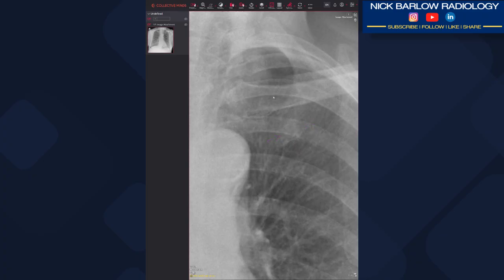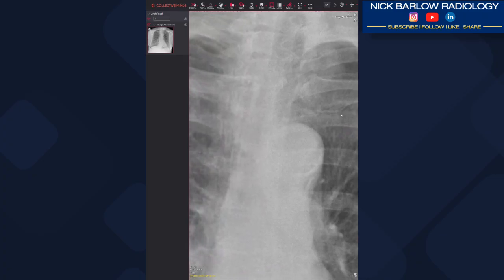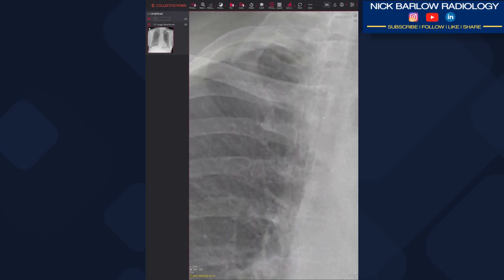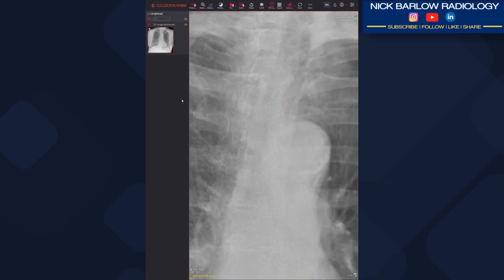Chances are that this is calcified costal cartilage. If we look on the right hand side we do have a more well-defined opacity here at the end of the first rib, and we can see it's continuous there on the underside of the rib — so that's definitely costal cartilage.